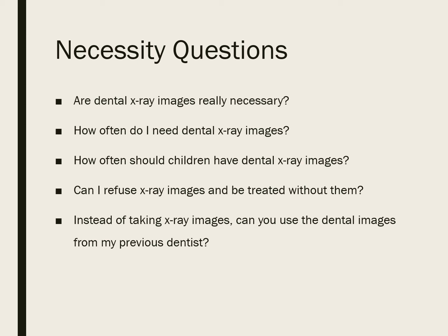So maybe their office sent you a picture of radiographs and we're not able to actually diagnose anything from those pictures of the radiographs, well, then we would need to retake them. And it's important to discuss that with your patient, that even though they've had x-ray images sent over from their other office, if they are too old or if they are not diagnostic, then we will still need to retake them. And refusing to retake more x-rays is considered refusing treatment. And so you would have to not be seen.